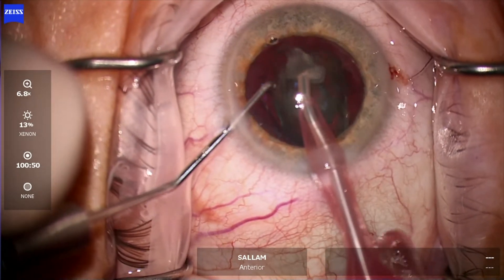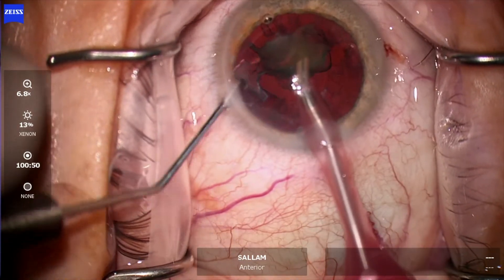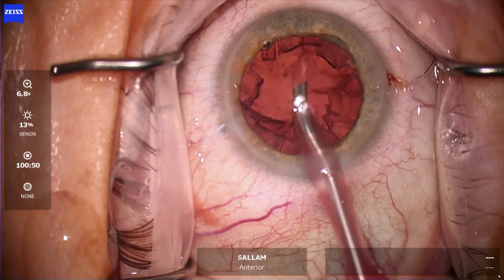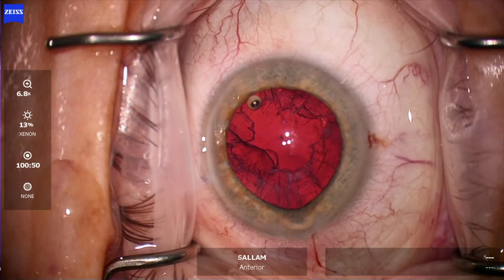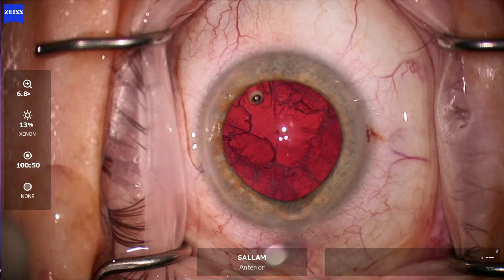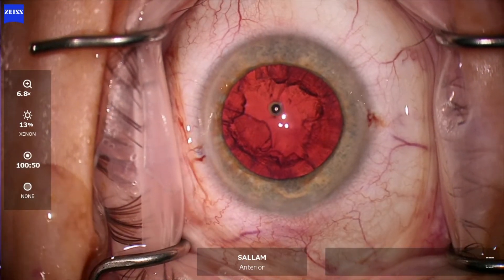Now it's getting easier. For the last quadrant, I always look at the amount of leakage from the side port — that will all stop when I take the second instrument out. The last quadrant I like to work single-handed. The iris here is thinking of prolapsing but it did not.